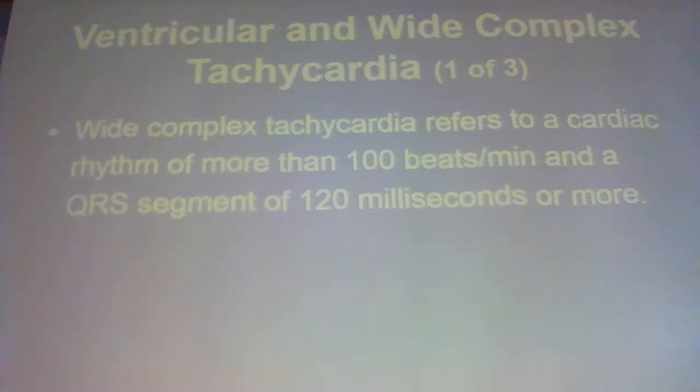It's not that hard. Right? And we use those numbers. That's the easiest way to do it. Just use your number. Now, on that 12 lead, does it show the P wave axis on those 12 leads I gave you? Yes. And what's the first number? 79. Okay, and what did I say it was supposed to be? Zero to 75.